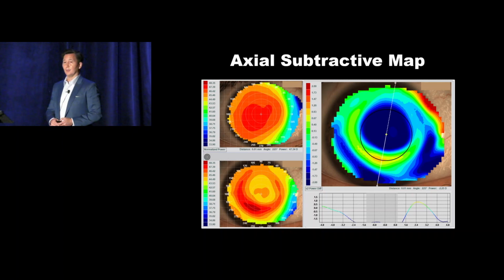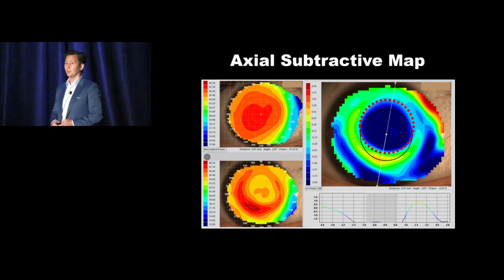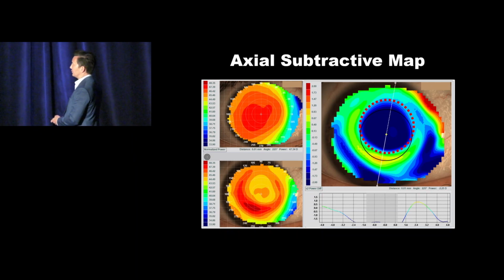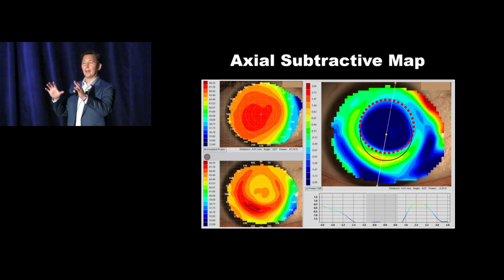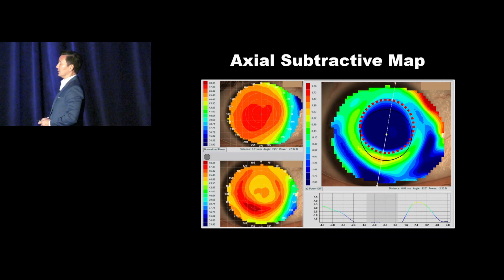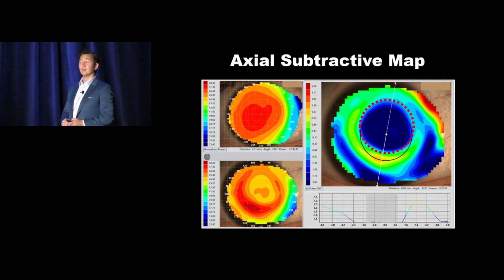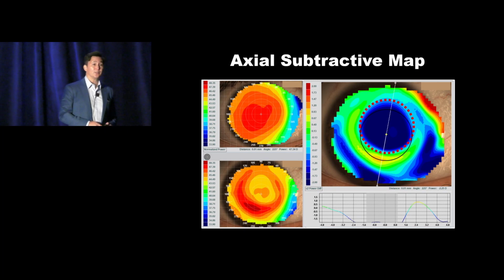Now here you can see the blue treatment area in the center positioned high in relationship to the pupil. And that gives you an associated little smile down here. It could be humongous, it could be very acute, but ultimately you see that blue treatment zone riding very high in relationship to the pupil. This is what's called the smiley face, and this one is very, very common in orthokeratology. Often because when the patient closes their eye over the lens, you've got all these tension forces, lid tension force, pulling the lens up. So you might have the perfect fit, but you get a smiley face just because the alignment zone is not tight enough.